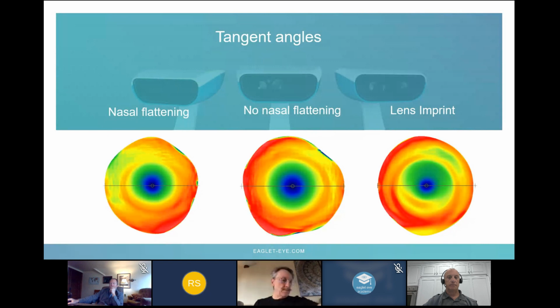Both our guests do have both systems, so let's ask them. Brian, you first. Instead of an OCT, no, because the OCT has so many other functions in my mind. Not least of which, looking at the retina. We're all guys that deal with the windows, but some of us have to look at the wallpaper on the back of the room. So we need the OCT for day-to-day general patients. We're not only a contact lens practice, where everything, babies to grandmothers, front to back of the eye. So no, we need an OCT full stop. And it happens to take great anterior functionality for scleral fits, but that's post-fit, not pre-fit, really.